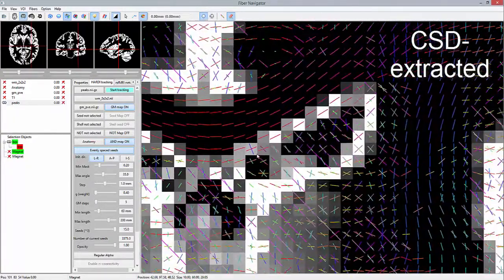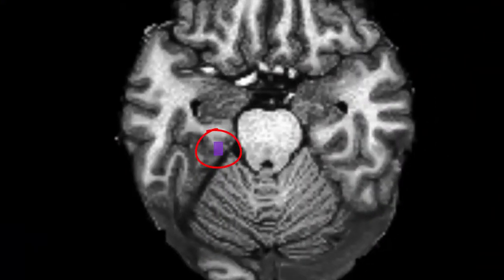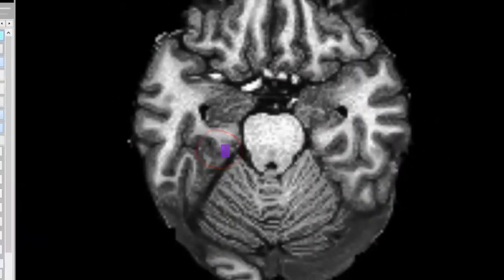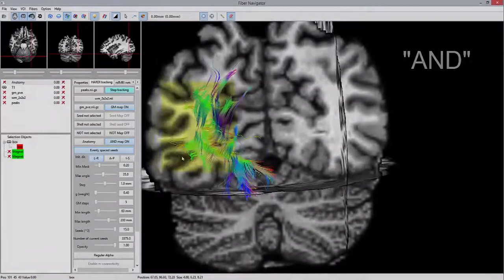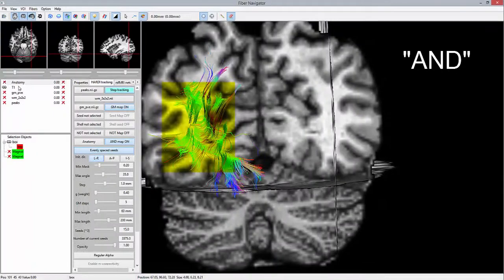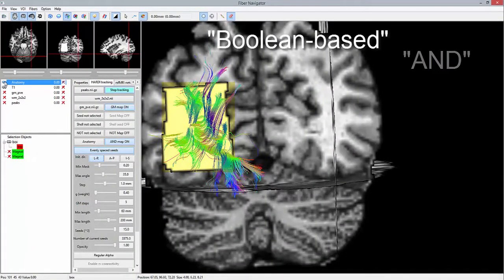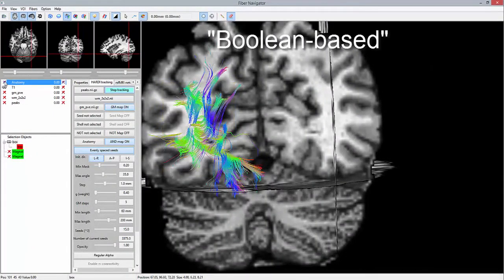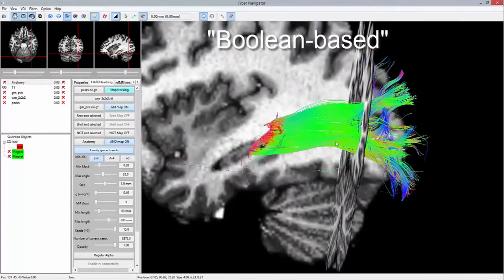Seeds are interactively initiated from the following purple region of interest, located next to the LGN. An AND region, located at the mid-body of the optic radiation, serves as an inclusion ROI.